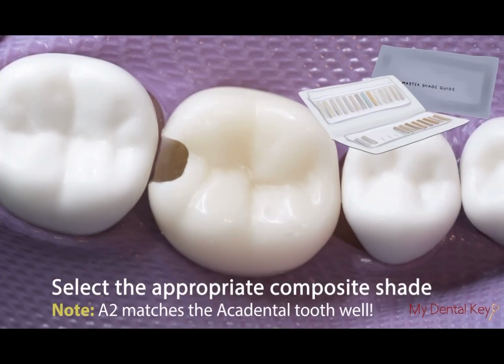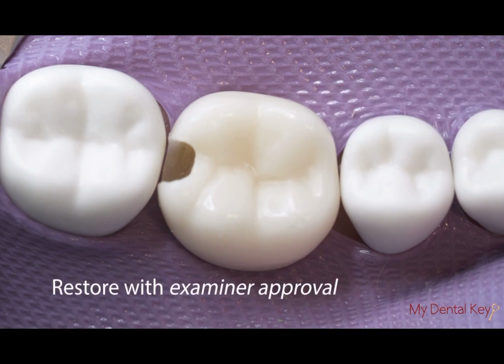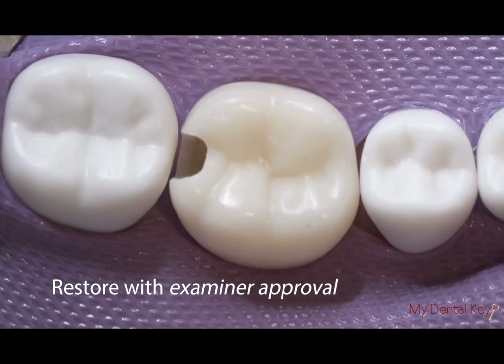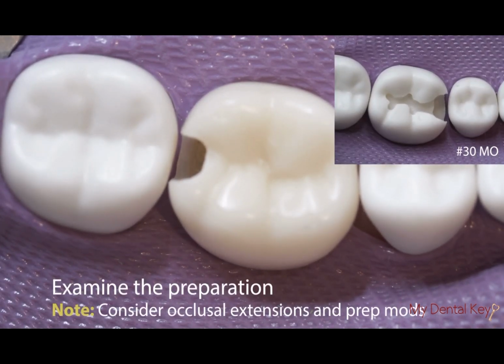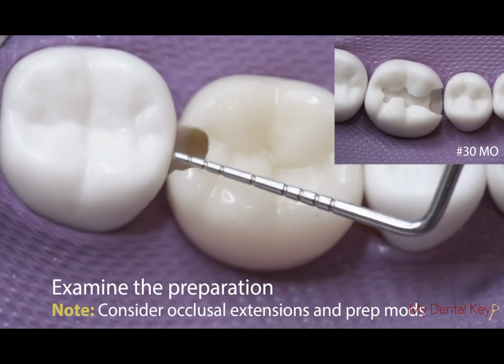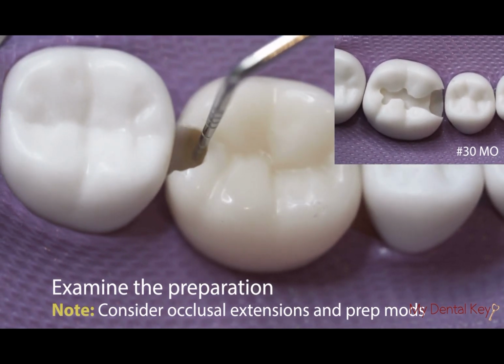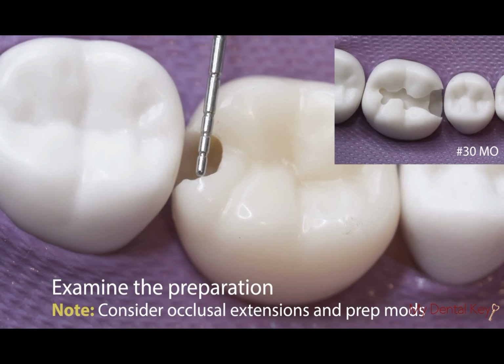While not a specific part of the CDCA guidelines, it can be helpful to select the appropriate composite shade to help mask any imperfections in your restoration. Before proceeding to the restoration phase of the exam, ensure that you have received approval from the CDCA or ADEX examiners. It's highly likely that on exam day, you'll be required to create an occlusal extension for your Class 2 preparation. This video identifies how to perform a restoration for a slot preparation specifically.